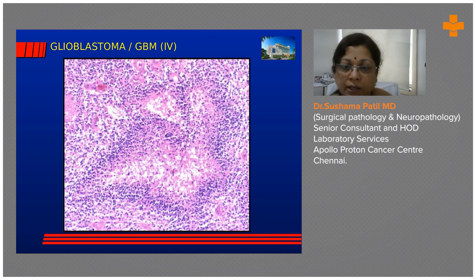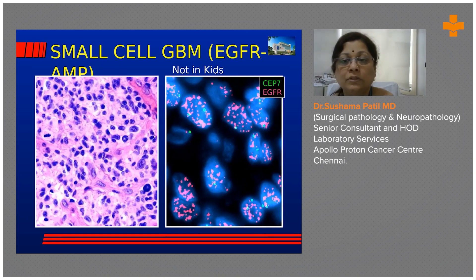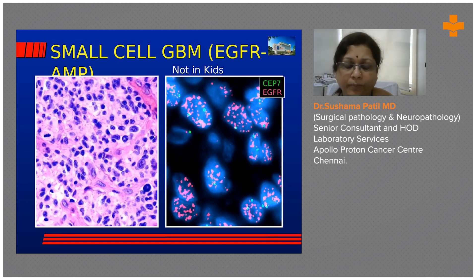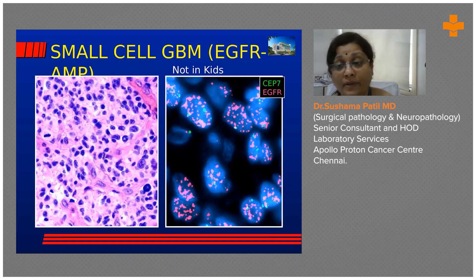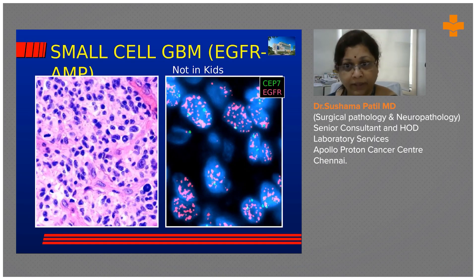Palisading necrosis is a hallmark feature of a high grade glioma — we call it GBM, glioblastoma. Another type is the small cell variant glioblastoma, which is most often mistaken for anaplastic oligodendroglioma. This is a very aggressive tumor and you should not miss it. The cells are very bland but mitotically very active. When you see those two things together, you should worry about small cell GBM — and most of the time these have EGFR amplifications.